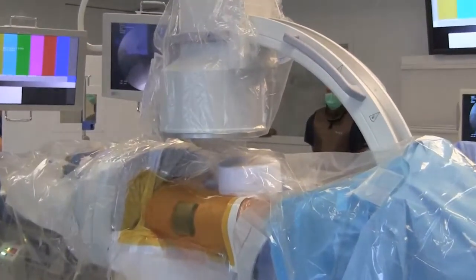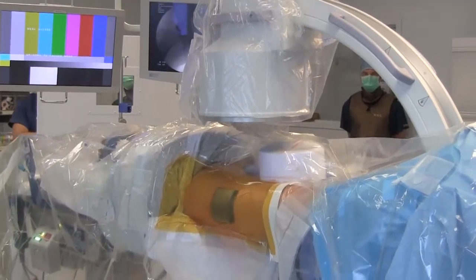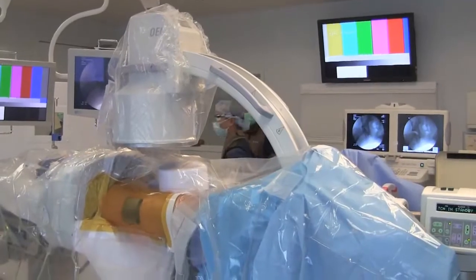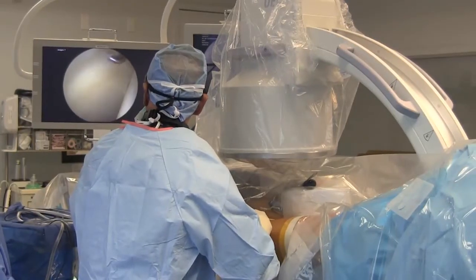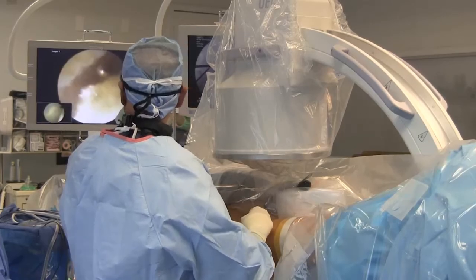Here is the supine arthroscopic setup for the right hip. After sterile draping, note at the head of the bed the adjacent arthroscopic and fluoroscopic monitors, the latter for real-time on-demand spot imaging. Hip distraction is applied for initial central compartment access as well as initial central compartment diagnostic and therapeutic work.